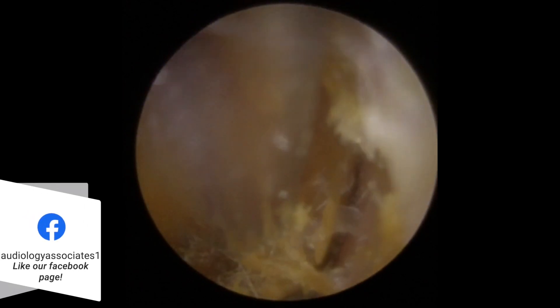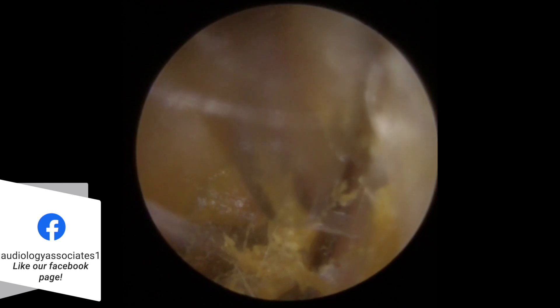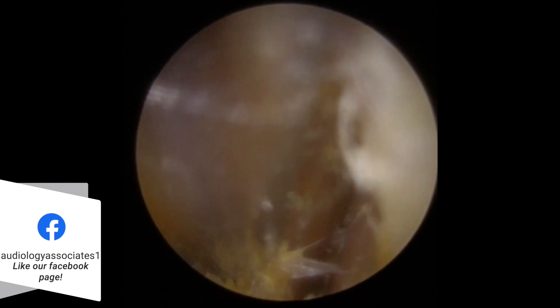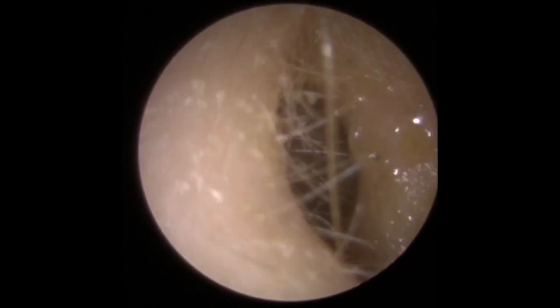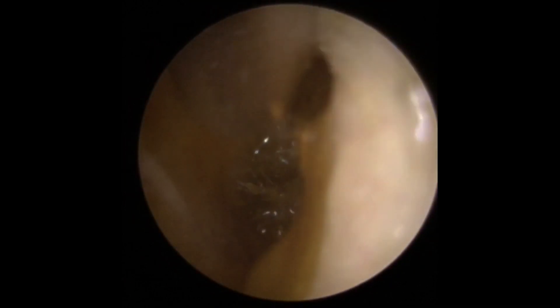Just lifting from the canal wall — now it's starting to detach a little bit. It's really sticky and really stuck to this canal wall. Just slowly working our way up the side of the wax. I've administered a little bit of olive oil now that we've detached it from the canal wall a little bit, so the olive oil can work its way down the side of it. If you look at the difference that makes when we get a grip — boom — out it comes.